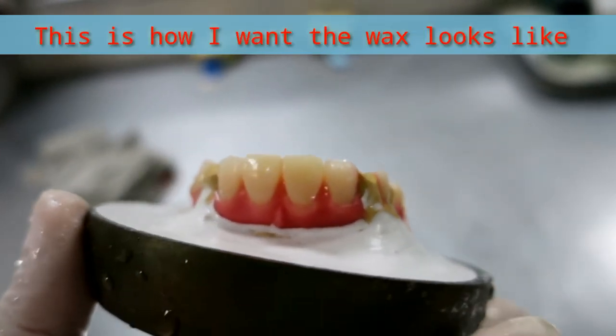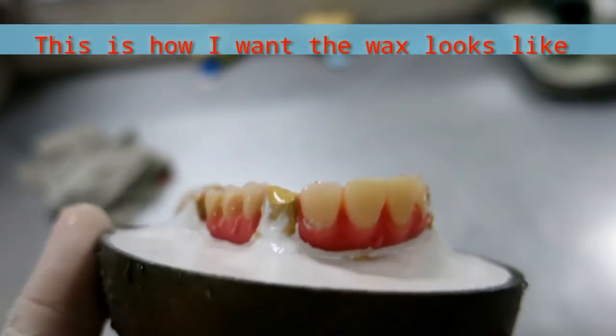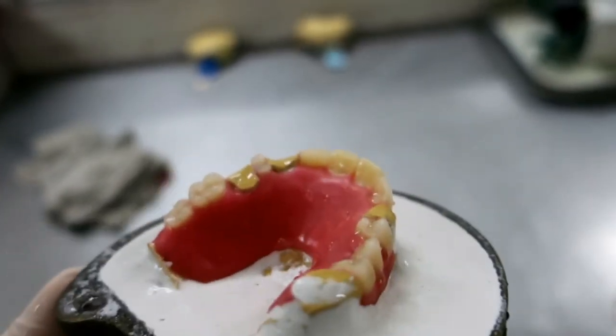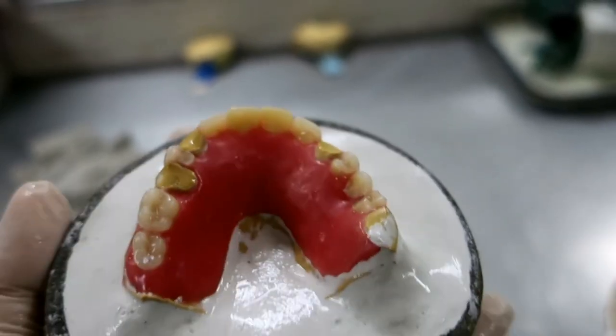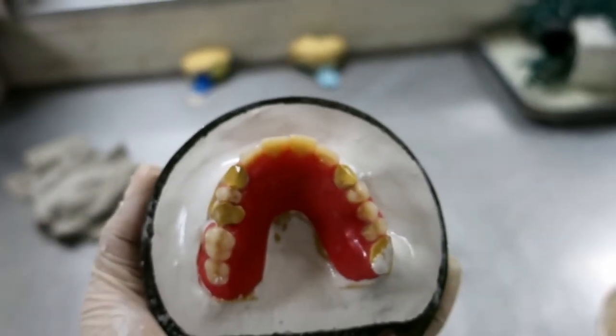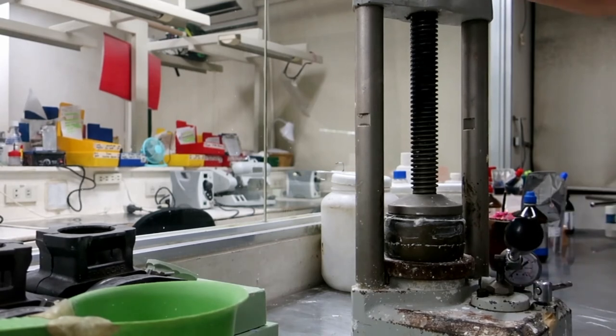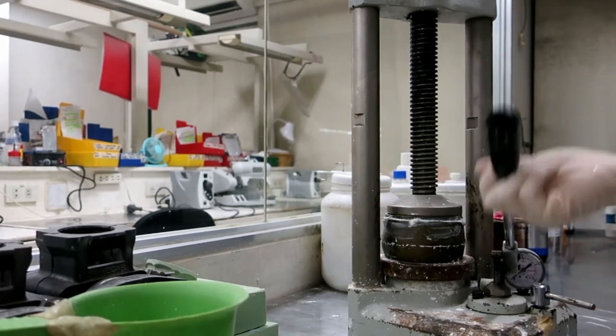This is after cleaning and exposing the borders of the wax denture. I used the presser after pouring plaster on the other half of the flask.